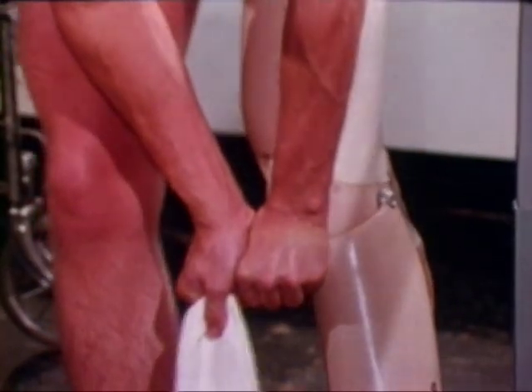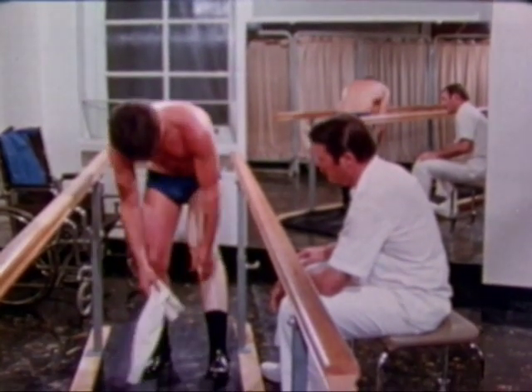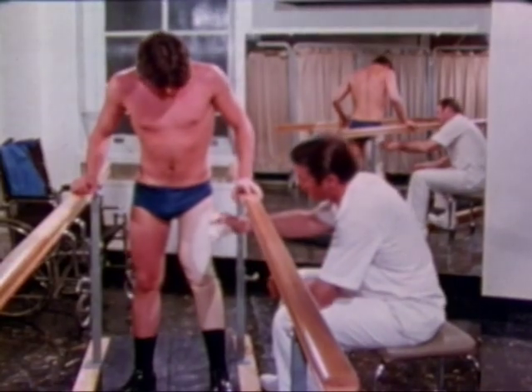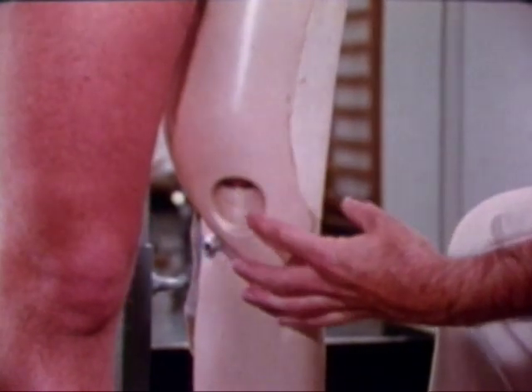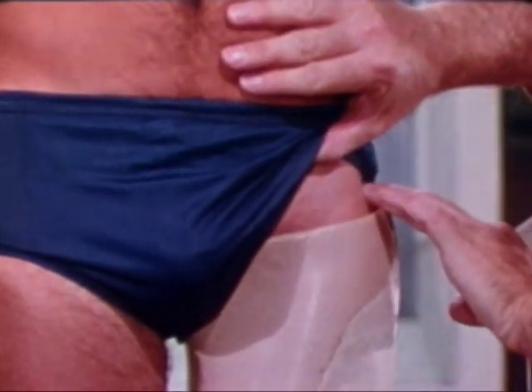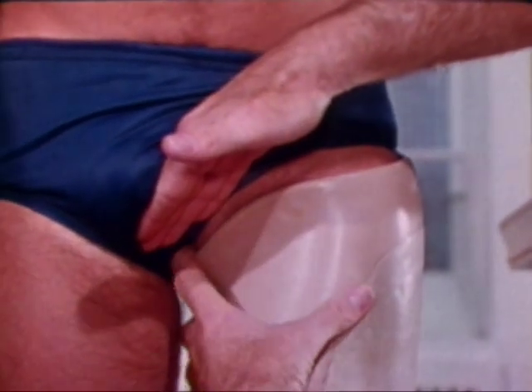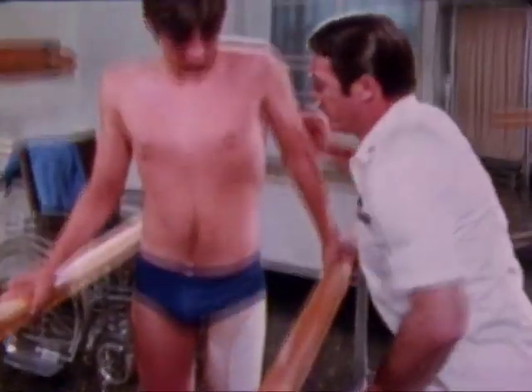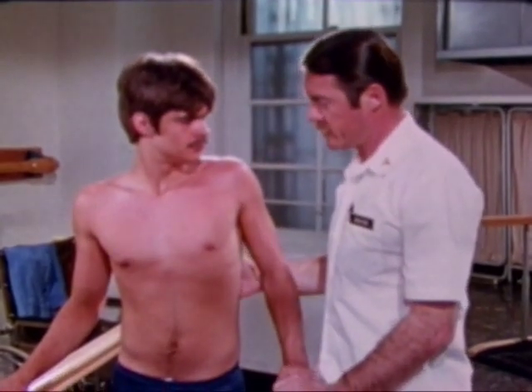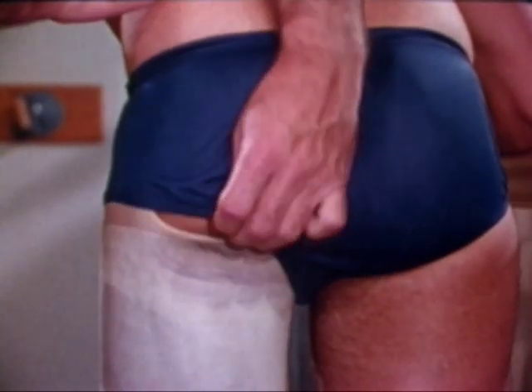The amputee must learn to apply his own prosthesis. After the first application, you check the fit. See that the stump makes total contact with the end of the prosthesis — there should be no air pocket inside. Around the top, there should be an appropriate amount of skin tension. A roll of flesh above the rim indicates improper seating of the stump. Feel the medial rim to make sure it isn't too high. The adductor longus muscle should be located in its channel for proper rotation alignment. The tuberosity of the ischium should ride on the ischial seat.